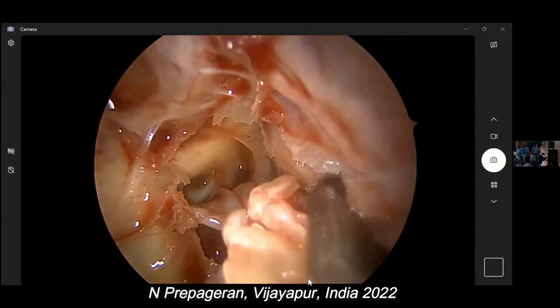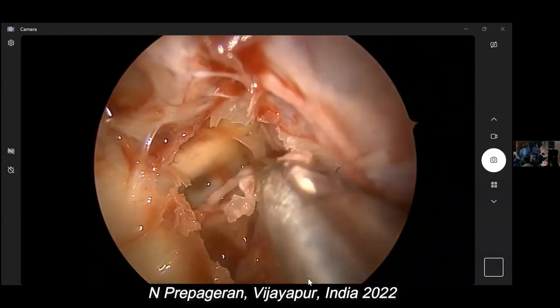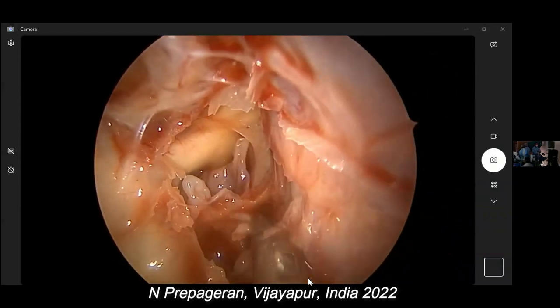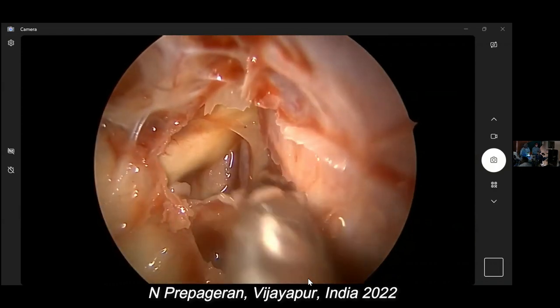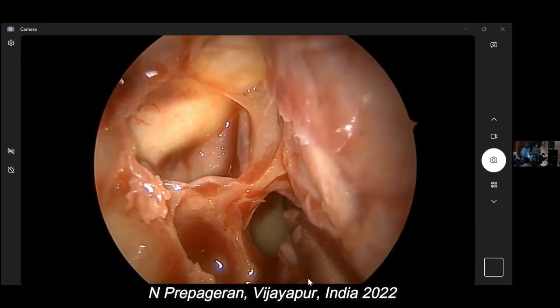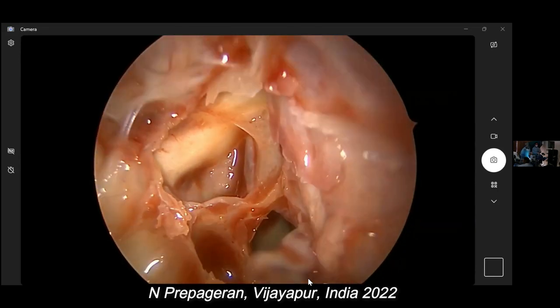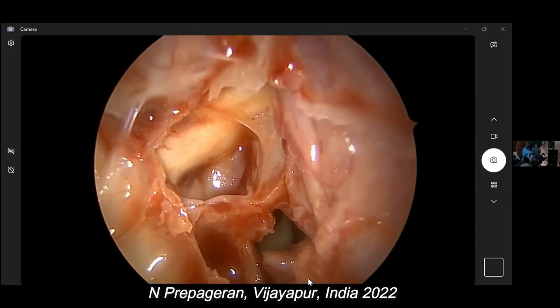So is that sphenoid or Onodi? This cannot be sphenoid because it's a horizontal shelf. When you have a horizontal shelf, it has to be an Onodi. And this is your opening of your sphenoid. Can you see? Okay, so this is a classical Onodi cell. Clear, guys?